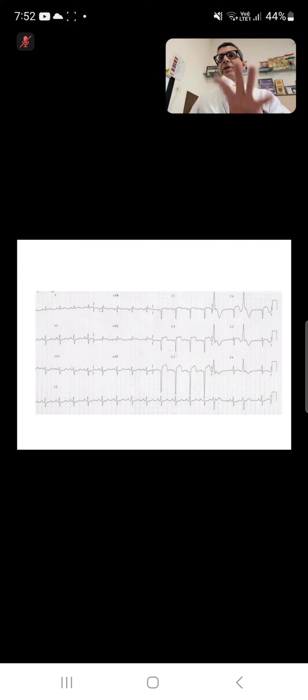So first, think about these possibilities when the patient has persistent ST elevation, then find out what is producing it, and based on that, plan the management strategy. That's the importance of just a small, simple ST elevation with Q waves in a patient who has come to you after about 3 or 4 days. Is that clear? Any questions on this? VPCs we will come to later, how we differentiate a VPC from supraventricular ectopics.